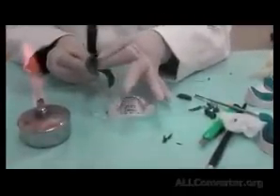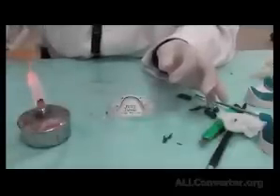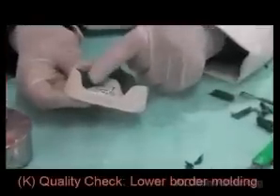So, added the border molding material, gathered it together, tried to remove the excess, heat it, make it shine, put it back in warm water, and then press inside the patient's mouth. And I asked the patient to please protrude your tongue. Go back with the tongue, touch the hard palate backwards with your tongue, and move the tongue to the left and right.